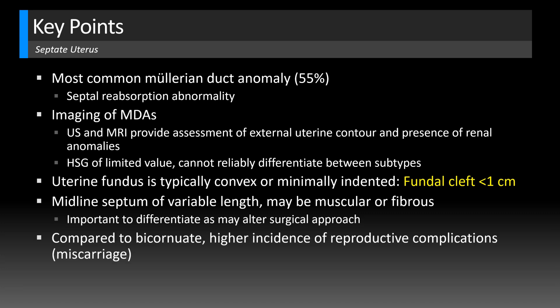Compared to bicornuate uterus, there's a higher incidence of reproductive complications — namely miscarriage — with septate uterus, so it is important to differentiate between the two on imaging. If a patient has recurrent fetal loss, resection of the septum might be considered, or even proactively as a patient is undergoing reproductive planning. This patient actually successfully had the septum resected.